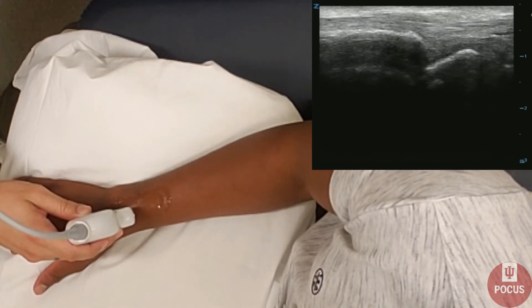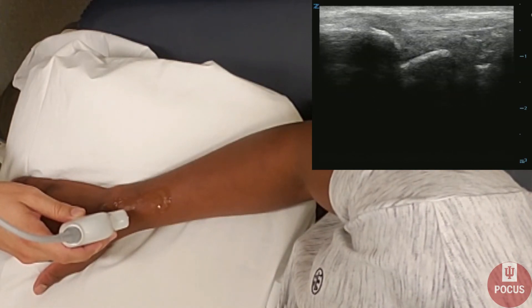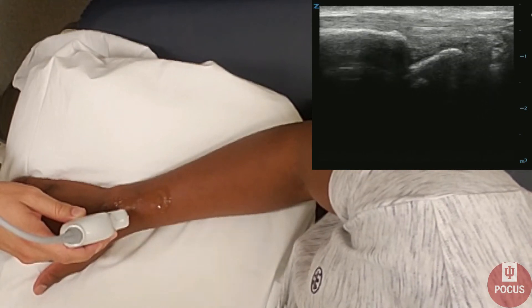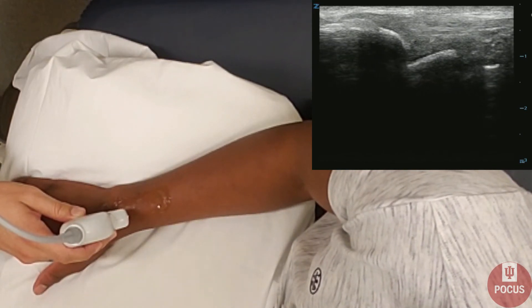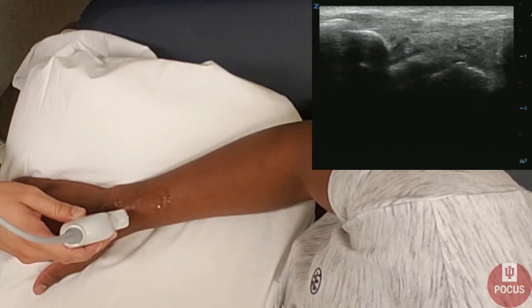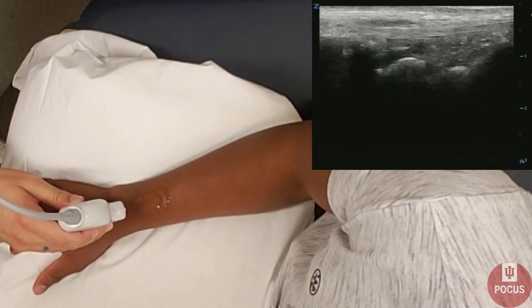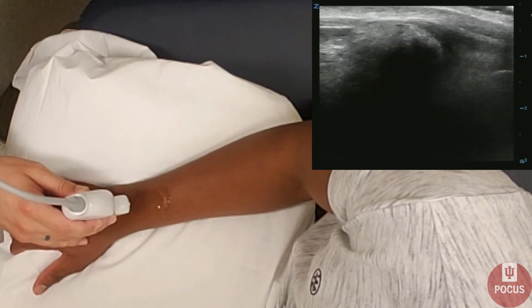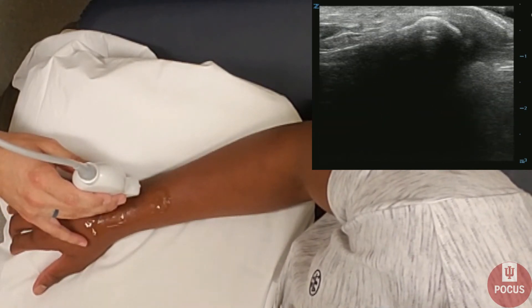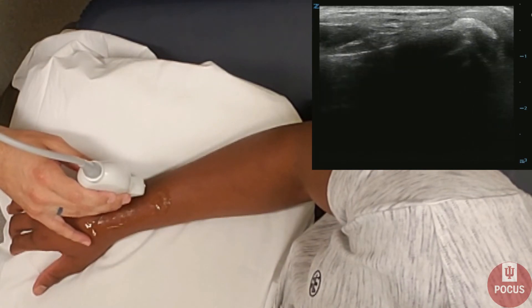Next, we'll look at the radiocarpal joint by going just distal to Lister's tubercle. A joint effusion would be a black anechoic spot in between the radius and the carpal joints. Remember, an effusion on ultrasound can be from many different things, so make sure you put it in clinical context.